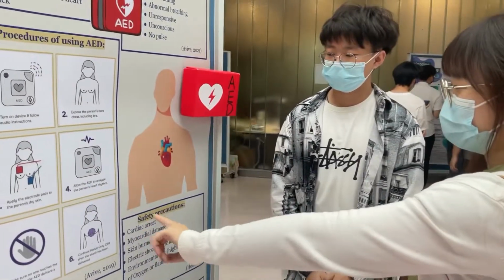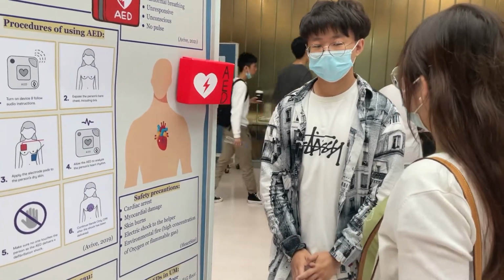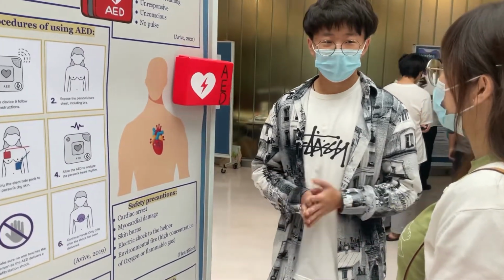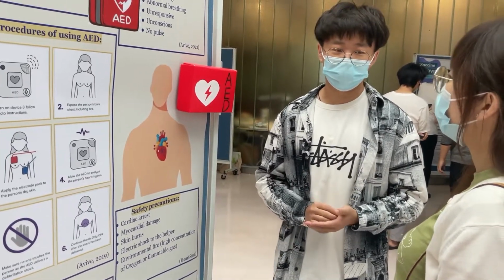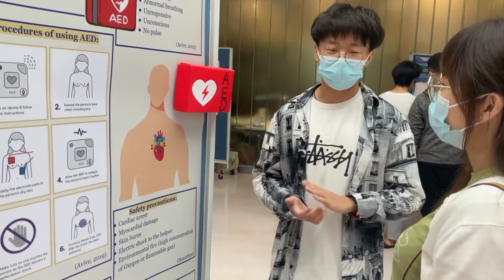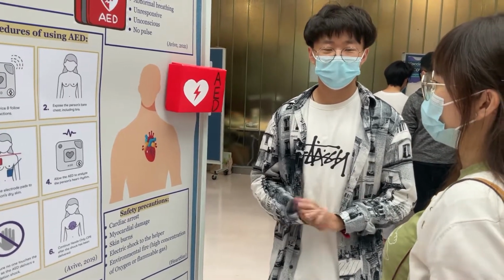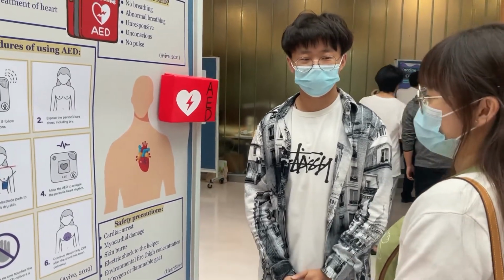Is it necessary to take off the women's bra too? It's not necessary, but if the bra has a steel ring in it, it is necessary to take it off. But if it doesn't have a steel ring, it is not necessary to take it off. So if she is wearing a sports bra, I don't have to take it off? Yeah. Okay, thank you.